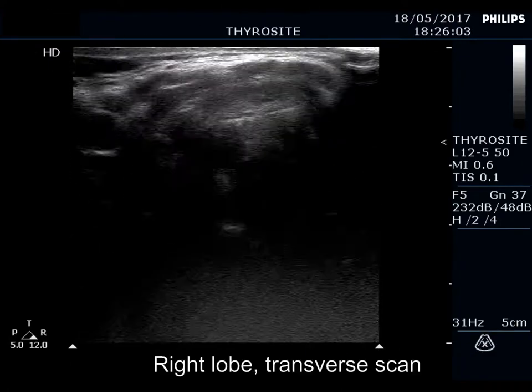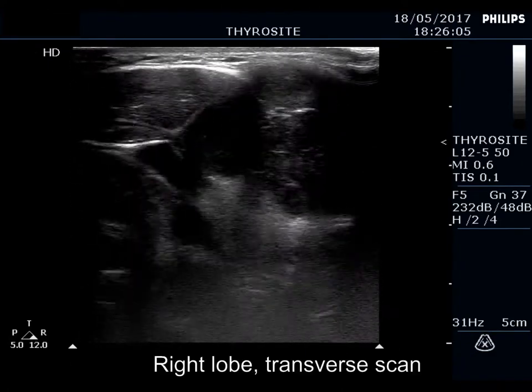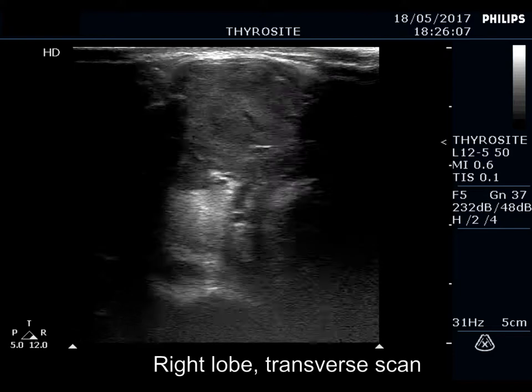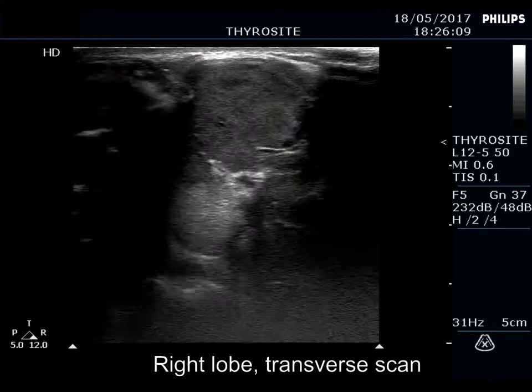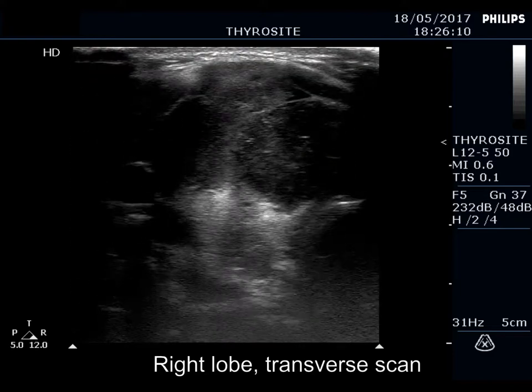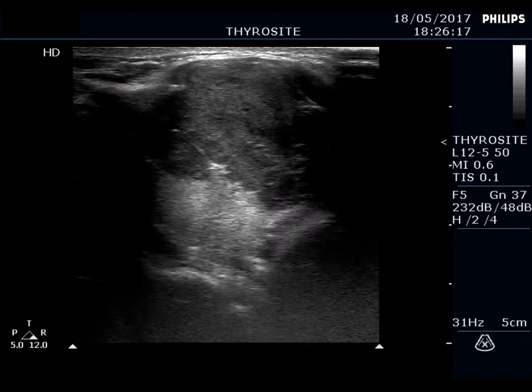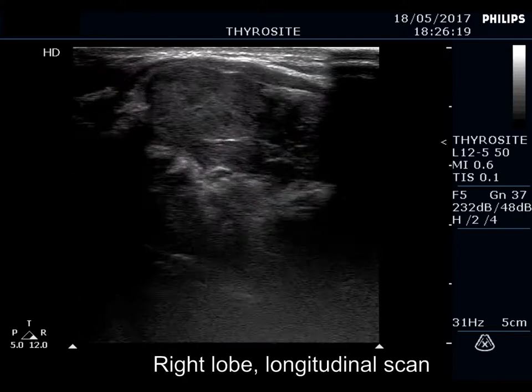If we consider the ventral wall of the trachea, it is evident that a great proportion of the mass is located ventral to the normal position of the thyroid. This means that the tumor presents bulging of extreme degree.